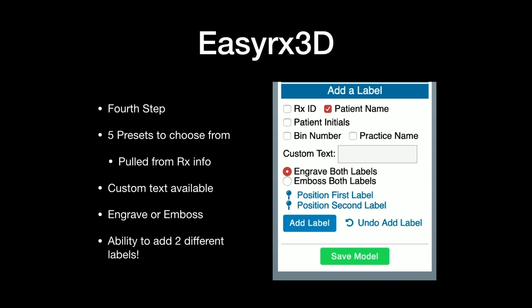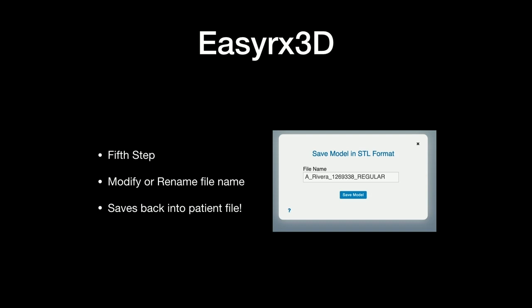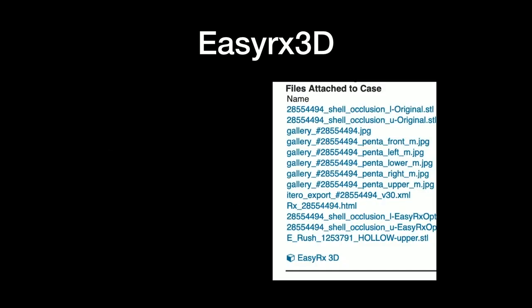The ability to add 2 different labels. So you can have 2 different labels, 2 different info that goes with the labels, and they come from the script. So these are all done kind of within the script of that patient. And then you go to save it. The 5th step, you can modify, you can name it whatever you want right here. And then it saves it back into the patient file. So now you have your files attached to the case.